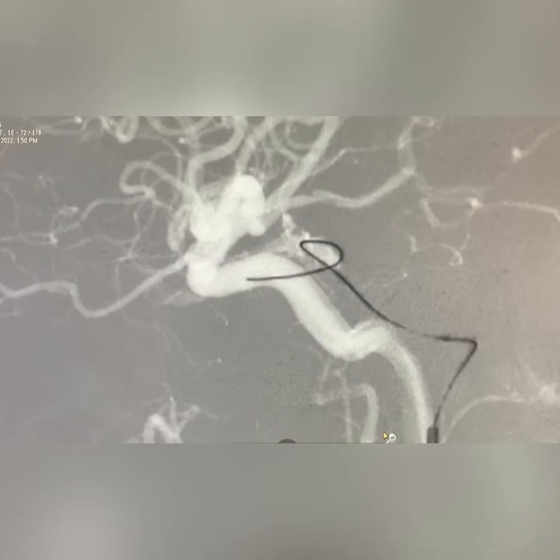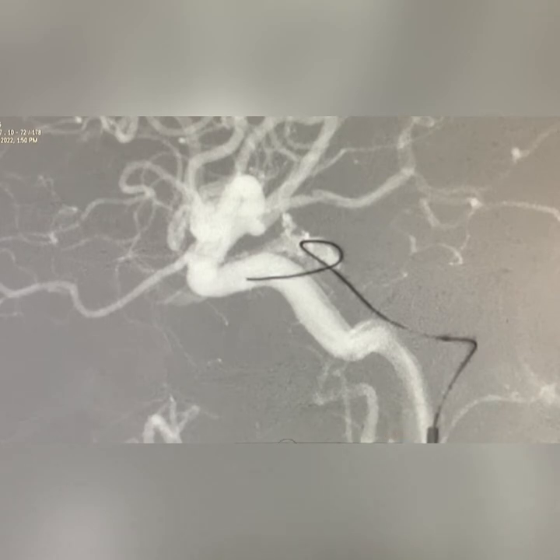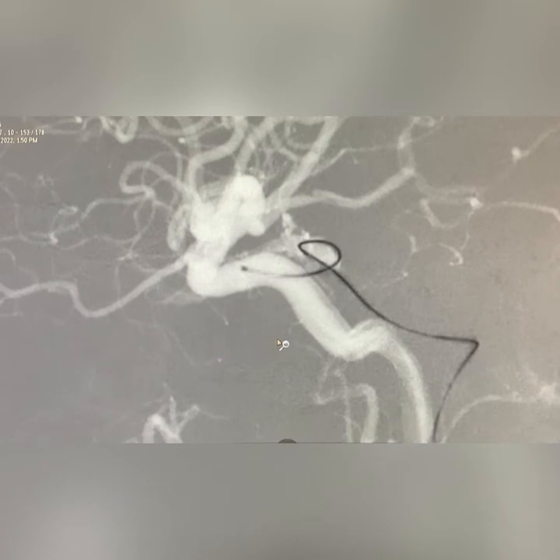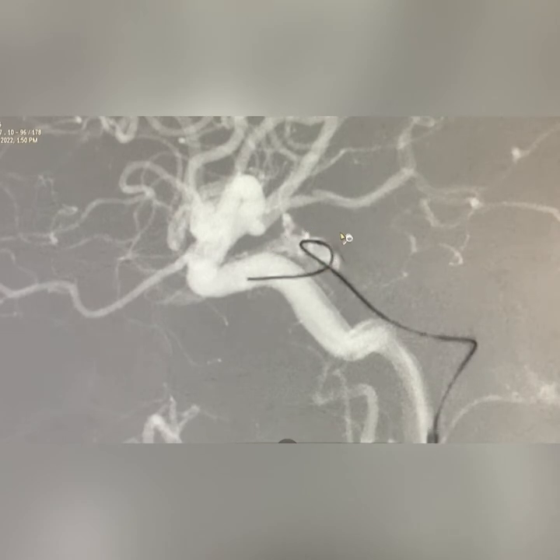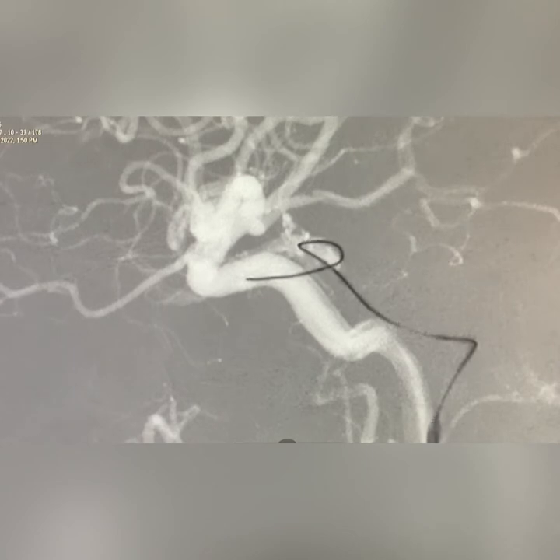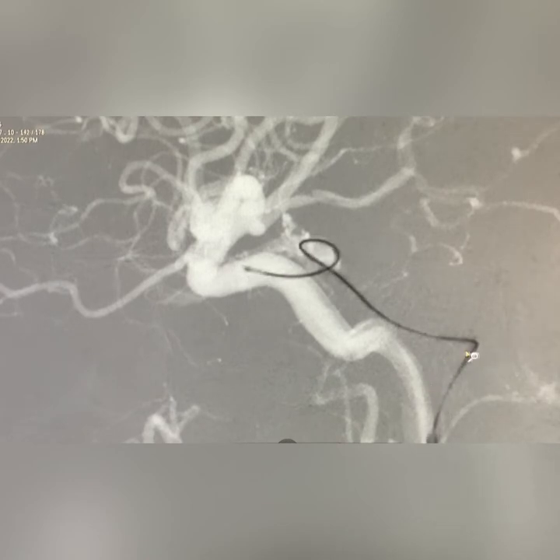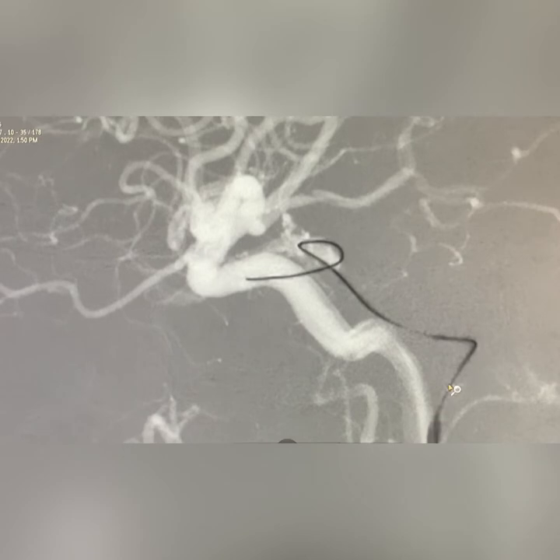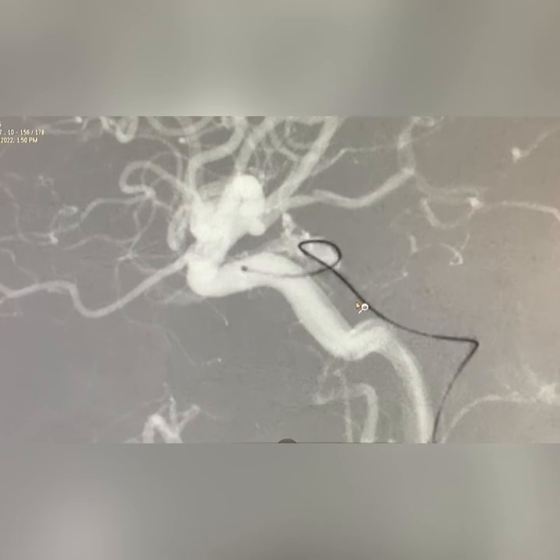Regarding treatment modality for this Type 4 carotid cavernous fistula, the treatment is always transvenous. For transvenous embolization, the first step is to place a diagnostic catheter on the arterial side so that during angiography, we capture the early venous phase opacification as a road map for the intervention. We then take another catheter from the venous side and navigate to the jugular-sigmoid junction where there is a convexity facing anteriorly. With a diagnostic catheter — preferably a vertebral artery catheter — pointing toward that area, we poke into it with the microcatheter and guidewire.